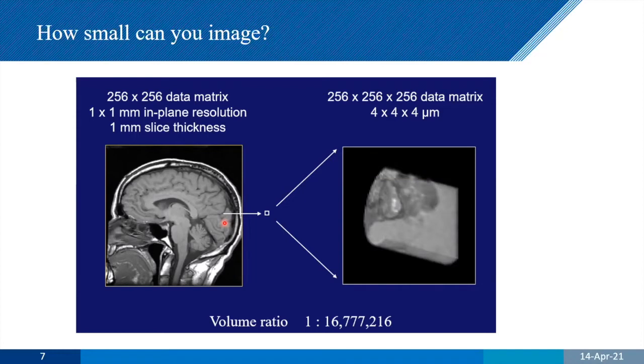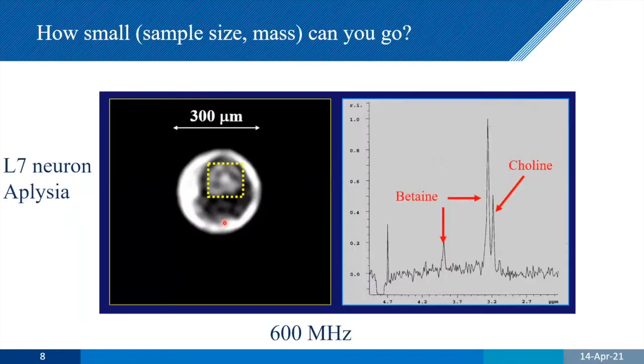So what can we image? If we can go down with these very small coils, we can start to image single neurons. So this is a well-studied biological system in Aplysia californica, looking at an L7 neuron. Now, to be honest, imaging is completely pointless at this thing from an MR point of view, because optically you can do this much better and you can do this much quicker and much cheaper. But what you can't do optically, of course, is look at the chemistry inside. You can't do spectroscopy, you can't make diffusion measurements.